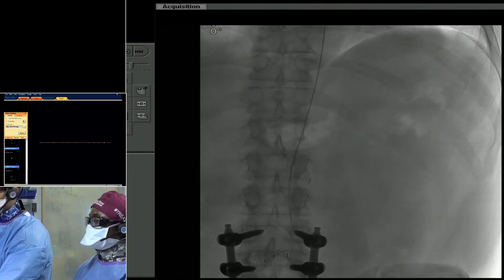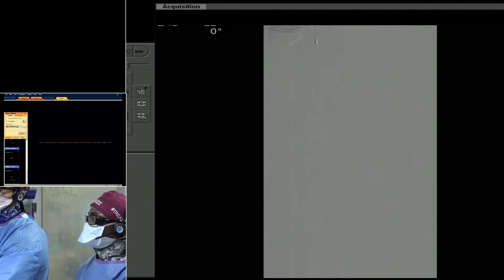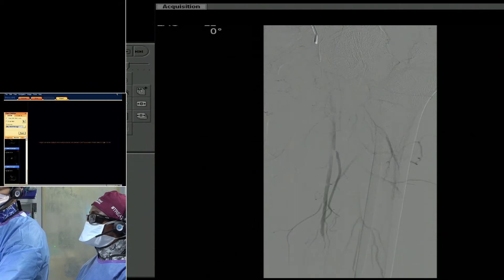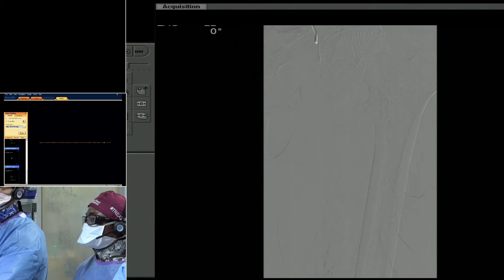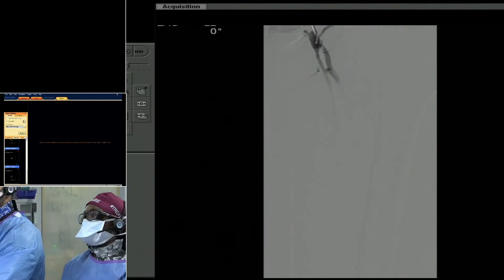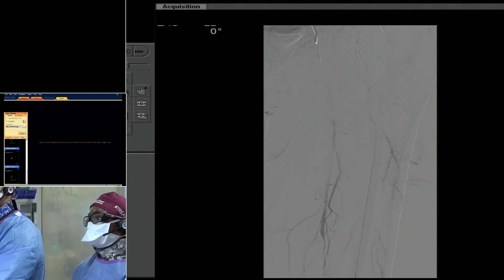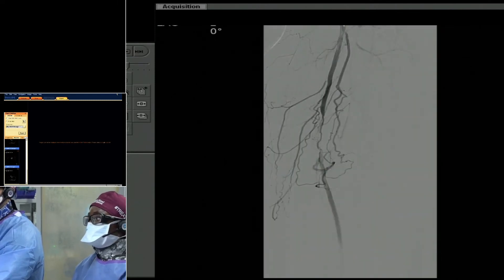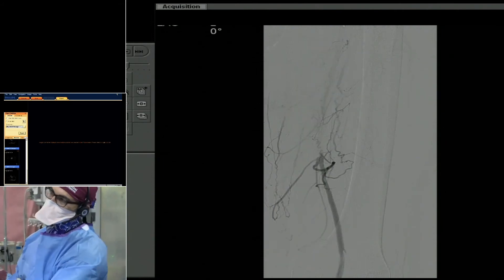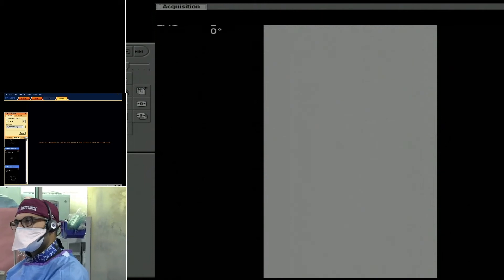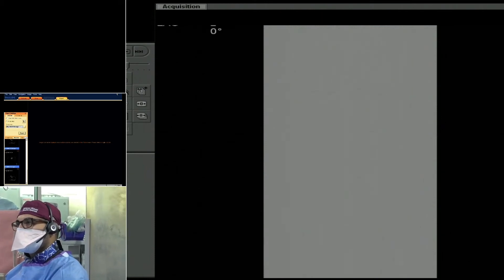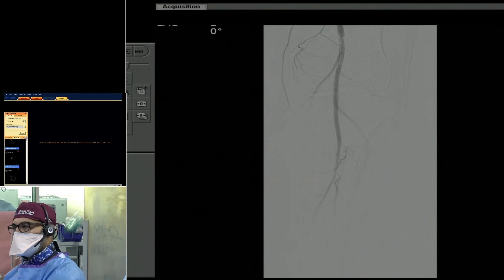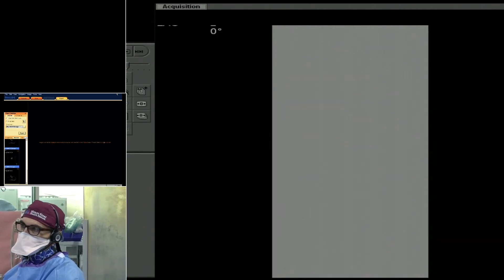Because it's a Dacron graft, we can be a little bit more aggressive in terms of how we cannulate it. Once we got down with the vertebral catheter, the area we previously treated looks maybe about four millimeters — slightly worse than when we treated it last year, but overall not too bad. You can see a huge discrepancy between the Dacron graft and the native vessels. We got down to the SFA and did selective angiograms. You can see this long, tapered stenosis, roughly about five centimeters in length. There's very sluggish flow beyond that stenosis and not very well collateralized, and even down to the foot — very, very sluggish flow.